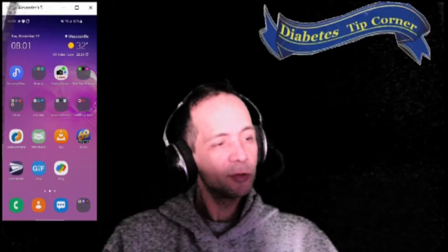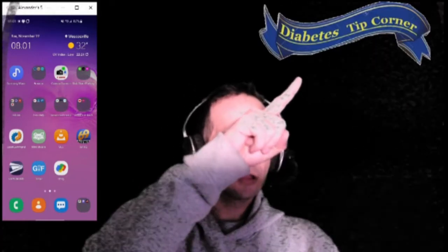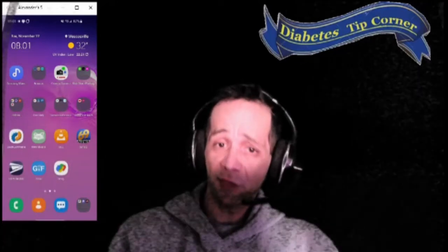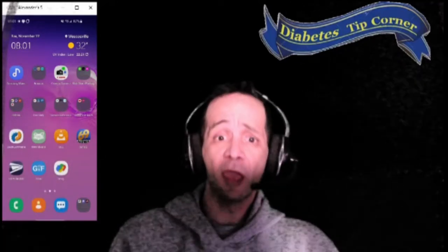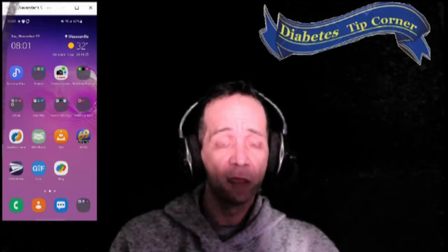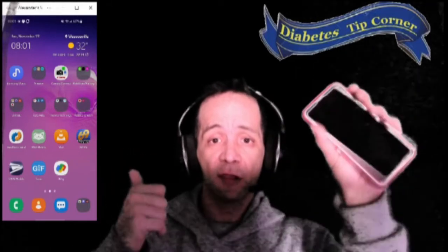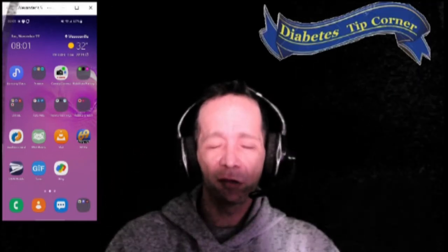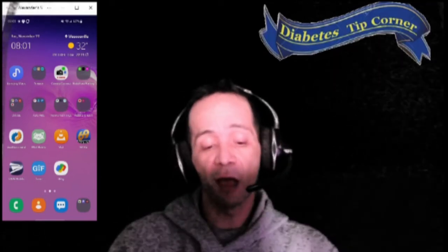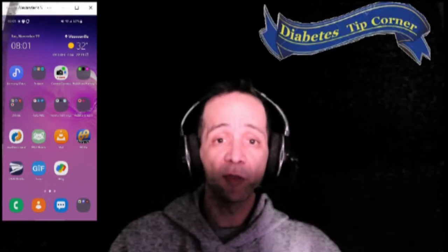Welcome back everyone to another wonderful edition of Diabetic Tip Corner. This is actually an issue I've seen on a number of forums, and after searching and searching I finally found an answer for it. What you see right over here is my phone screen — my Samsung Galaxy S10 — and the reason I got that is because it connects to control my OmniPod.